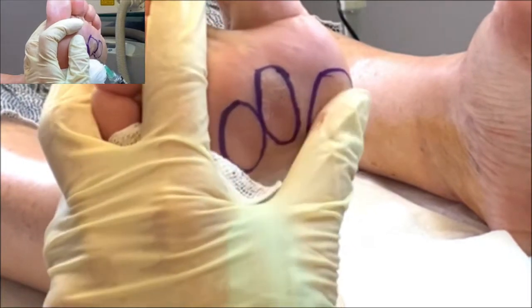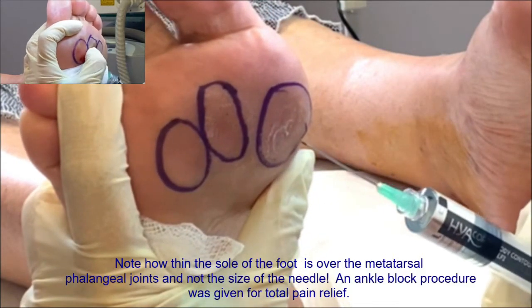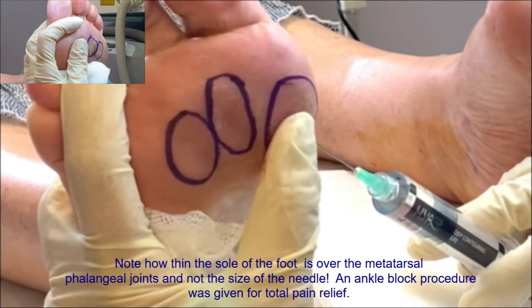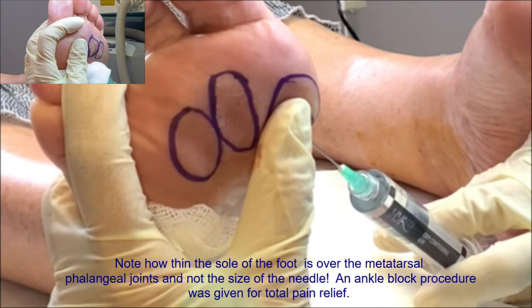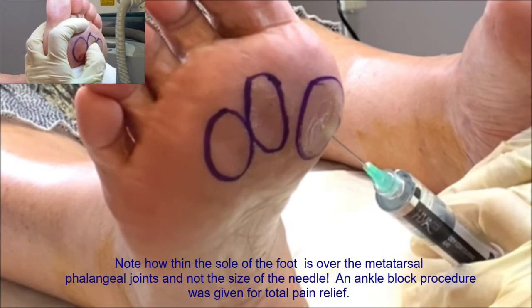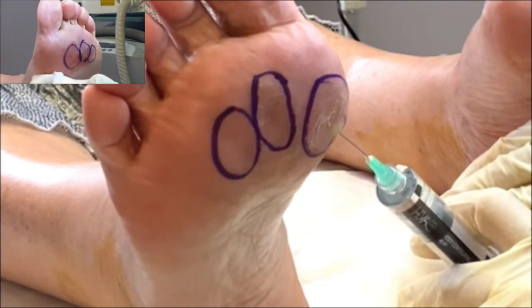Alright, here we go. Let's just check the camera — beautiful. We're going to go superficially, just underneath the skin, not too far in. And now I'm just going to fill her in there. You can see it's just much underneath the surface there.